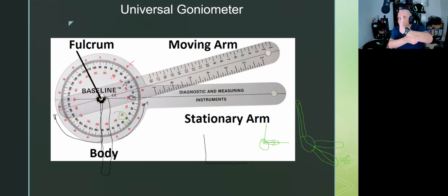What would you say my range of motion estimating for my wrist is? So here to here. Okay, so 80, I'm not quite at the 90 mark, but pretty close. Probably 80 to 85 degrees, right? Do the same thing with flexion, but anyway, so that's where you go. Let's say Josh is doing my measurement, and Josh says, okay, it looks like he's got about 80 degrees. But then Josh measures it, and out here's his goniometer, but for whatever reason, his brain locks on that red number.